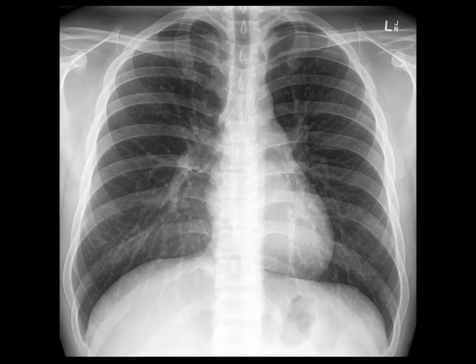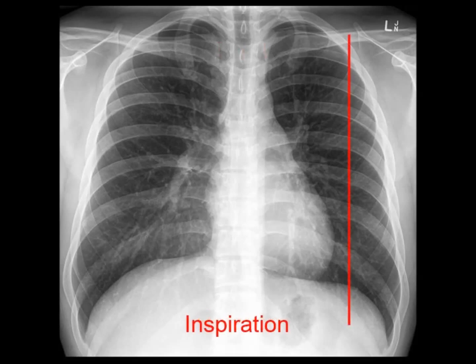To check rotation, look at the clavicular heads and spinous processes. If the spinous processes are halfway between the clavicular heads, the patient is normally rotated. Next, check for adequate inspiration by looking at the mid-clavicular line and seeing which anterior rib intersects the diaphragm at this point. It should normally be the 5th, 6th, or 7th. More ribs means the lungs are hyperinflated, often seen in COPD. Fewer ribs means the patient may not have taken a full breath when the x-ray was taken.